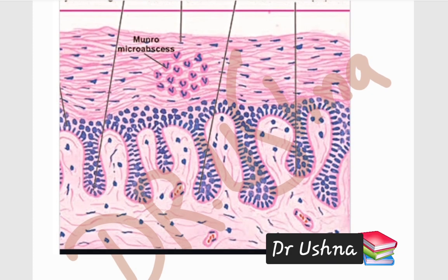Then when you see the layer immediately below your corneum, it is lucidum. Lucidum is only present in the palms and soles. Normally, normal skin does not have lucidum. So lucidum is out. After that, you should have granulosum. Granulosum is a normal layer. You should have very beautiful small granules arranged here in the basal layer. So we are not able to see that granular layer in psoriasis.